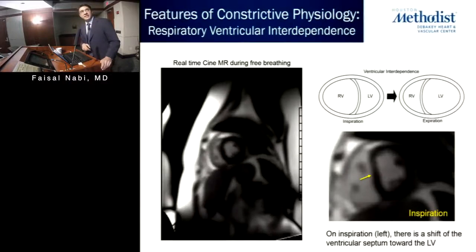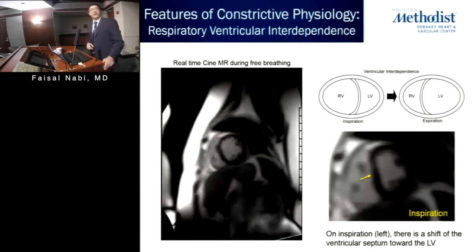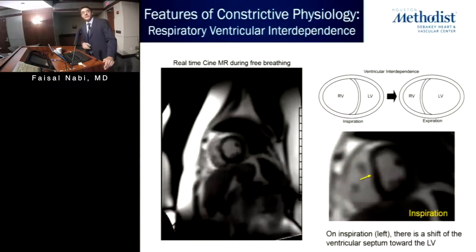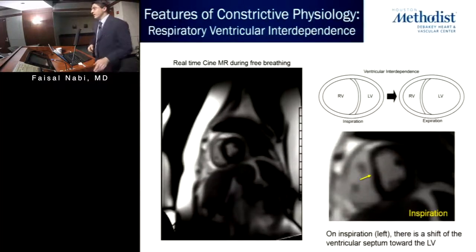And you can actually see this on these real-time images. Here, the patient is breathing on their own. We're just taking images of their heart. And you can actually see as the diaphragm descends, the ventricular septum will shift towards the LV, I'm sorry, and then will reverse itself on expiration. And this is just a still image of that.